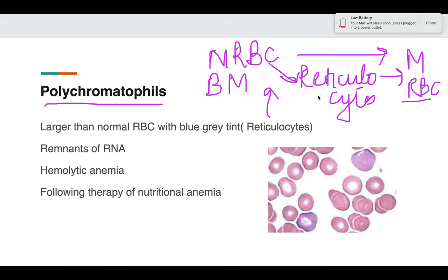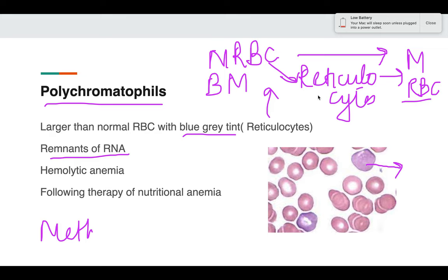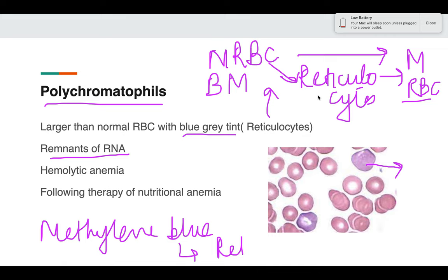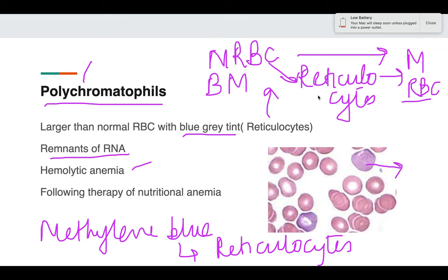Reticulocytes in the peripheral blood smear appear as polychromatophils — they have a different color, a bluish-gray tinge, and are slightly larger. This is due to remnants of RNA present in them. With methylene blue staining you can confirm these are reticulocytes, and the reticulocyte count will also be high. Polychromatophils are increased in hemolytic anemia, where increased breakdown leads to increased RBC production.